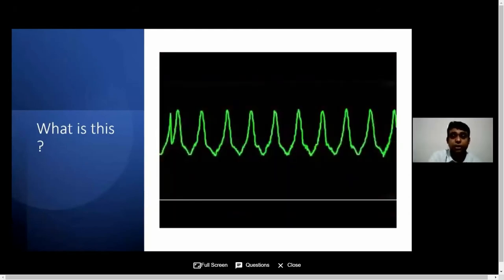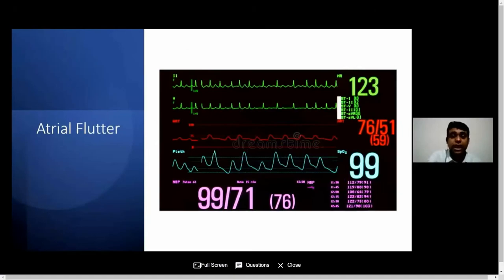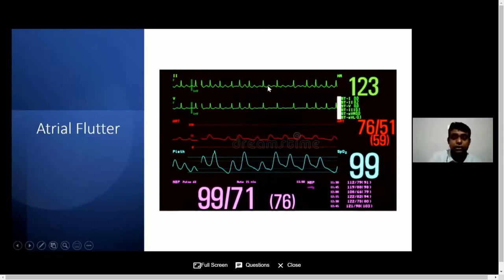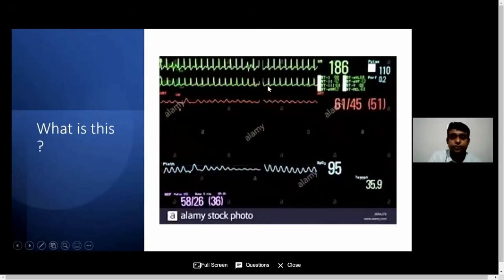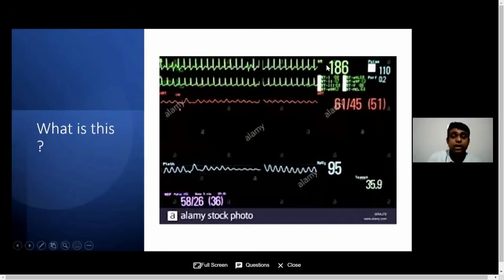This is a ventricular tachycardia on the monitor. And this is atrial flutter — you can see the blood pressure is all right, but the heart rate is going up to more than 100. And this is an SVT, a narrow complex fast tachycardia. Look at the heart rate — 186. Look at the blood pressure — it is low. This is a situation where you need to cardiovert this patient.